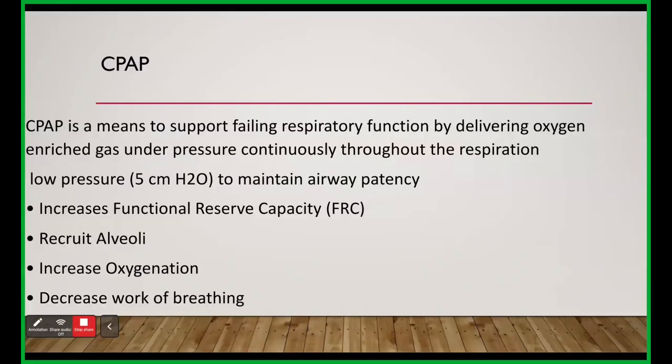Now coming to CPAP, for conclusion's sake, CPAP is an ideal mode for non-invasive ventilation, but it also finds its place in invasive ventilation as a tool of weaning. It is just a supportive mode for a spontaneously breathing patient with oxygen at a constant low pressure, say 5 centimeter H2O. It is just to maintain your airway patency. It helps in recruiting your alveoli, increases the FRC, increases oxygenation, and also decreases the work of breathing.